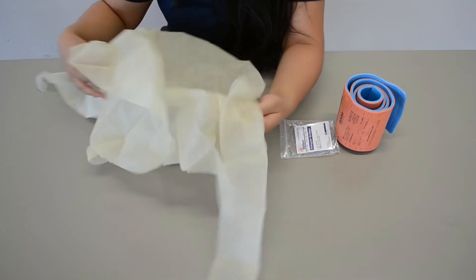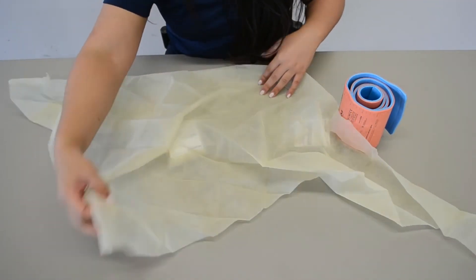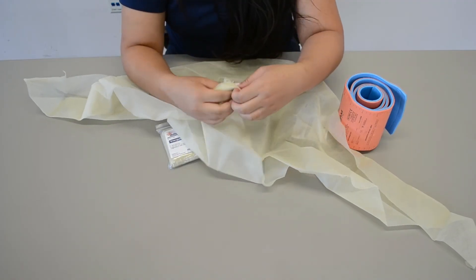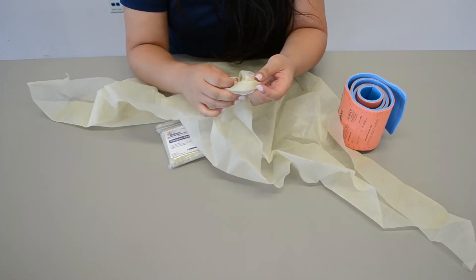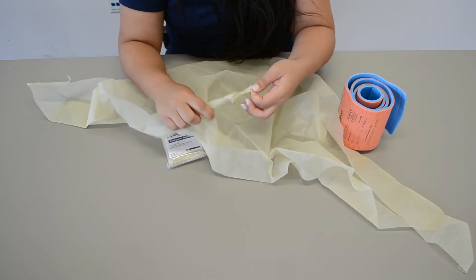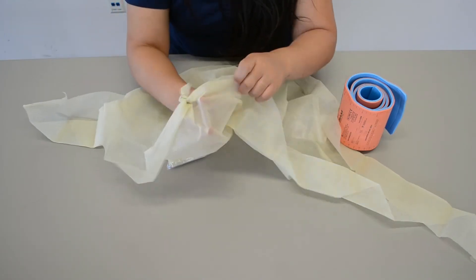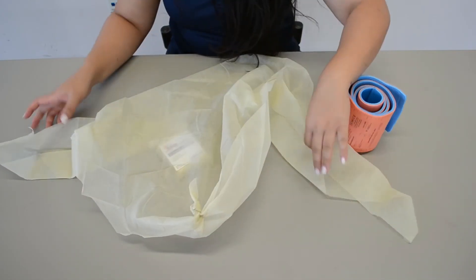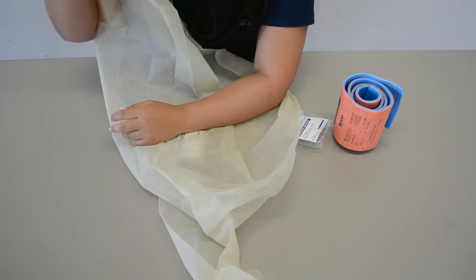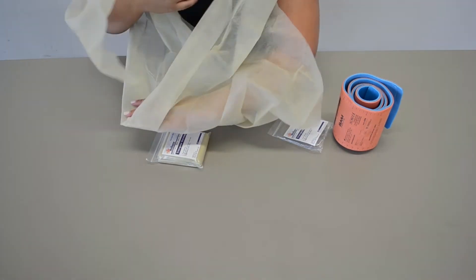And so if this one is going to be your sling, you're going to take the corner piece of the bandage and make a quick knot. And this is where you're going to place the patient's elbow. So you're going to have the patient put their elbow in, and then you're going to place it on the patient.